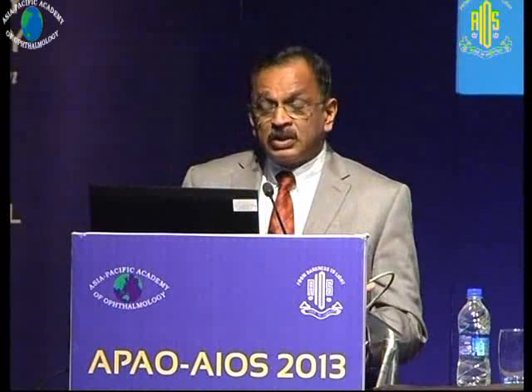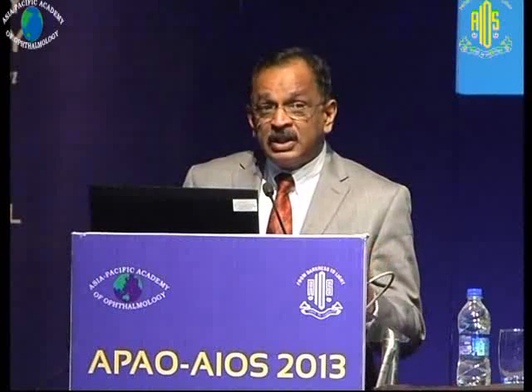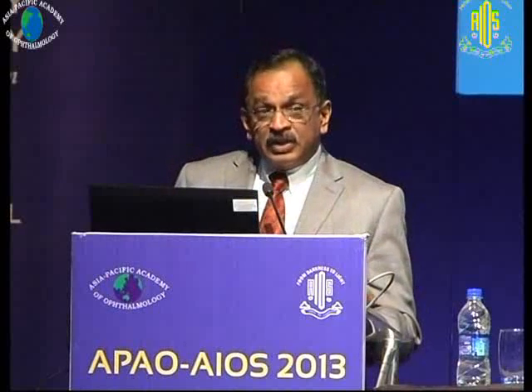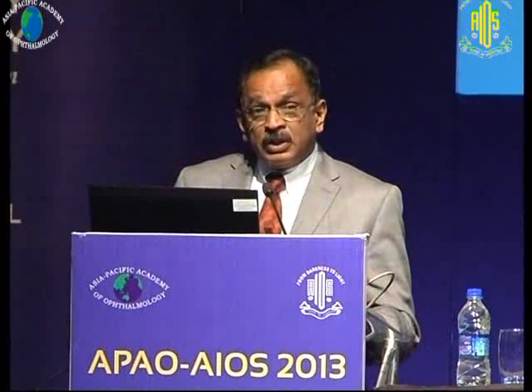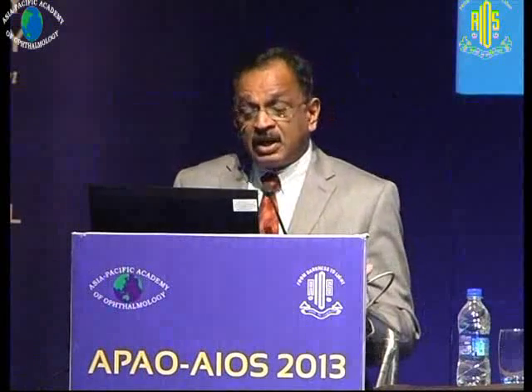There are a few rules of thumb for performing a relaxing retinotomy. As was shown earlier, you definitely need to have a good visualization of the entire retina. Do a good diathermy when you're going to do a retinotomy or retinectomy to the entire area to be cut or excised.